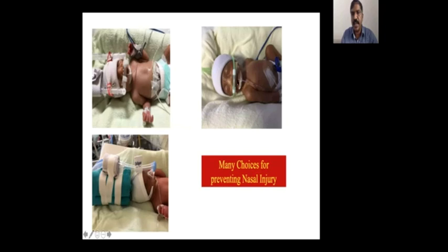But when you use Ram's cannula, never close the mouth of the baby. Don't use a pacifier or close the mouth of the baby or use a chin strap. Never use a chin strap. You should have the nostrils completely closed with Ram's cannula, but the mouth is open. Otherwise, there is no vent for air, and it can cause very bad problems of pneumothorax if you close the mouth also. So a snugly fitting Ram's cannula is as good as other interfaces for both CPAP and nasal IMV.